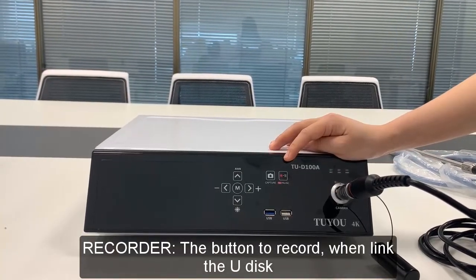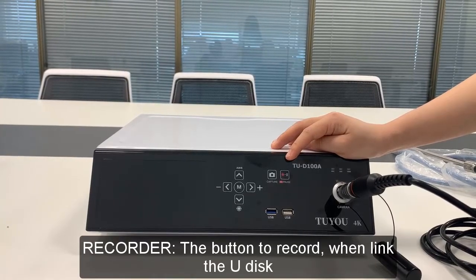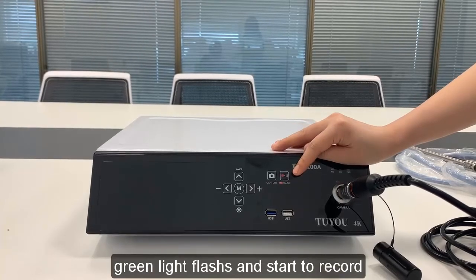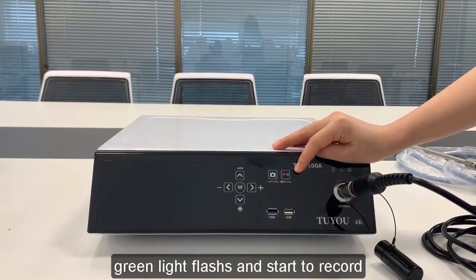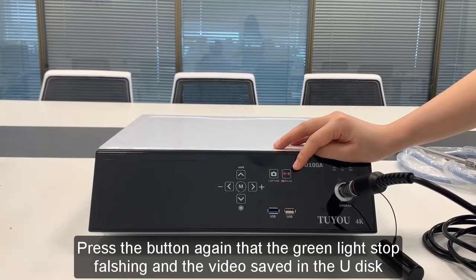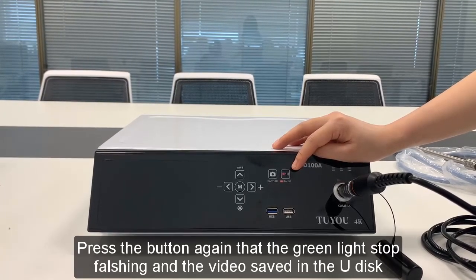Recording: press the button to record when the U-Disc is linked. The light turns green. Press the Record button and the green lights flash to start recording. Press the button again to stop — the green lights stop flashing and the video is saved to the U-Disc.